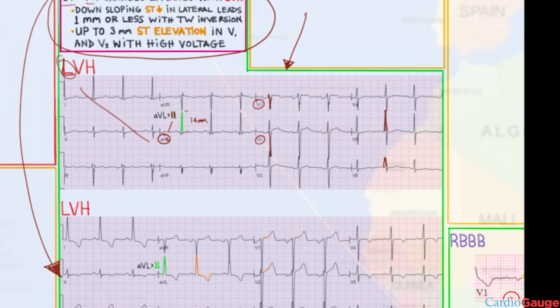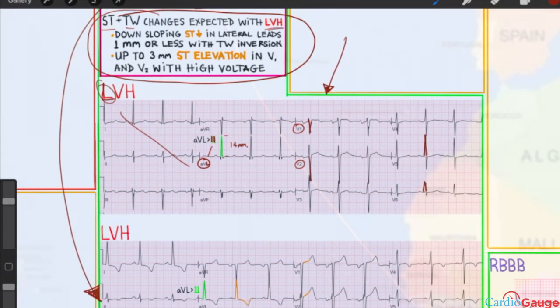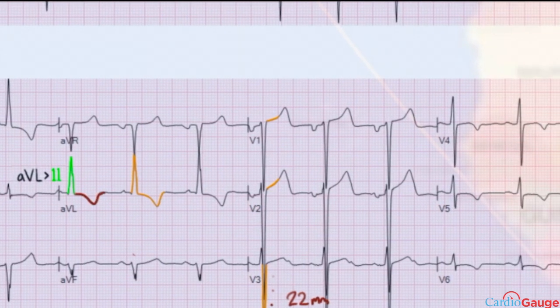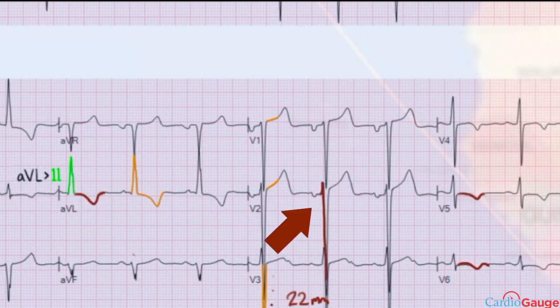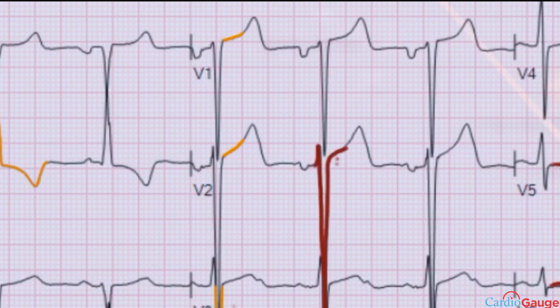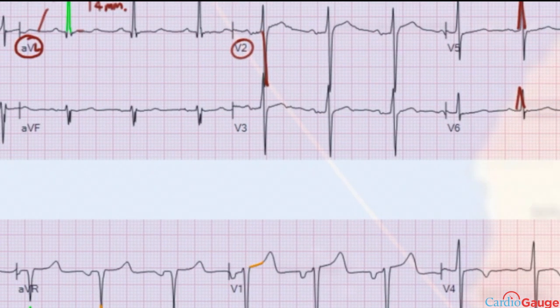There are ST and T wave changes expected with LVH. We expect to see a down-sloping ST depression of 1 millimeter or less in the lateral leads, with associated T wave inversions. Looking at the lateral leads, there's a down-sloping ST segment and then a T wave inversion — visible in all the lateral leads. Additionally, there's up to 3 millimeters of ST elevation in leads V1 and V2, typically with high voltage. For example, in V2 there's a really big S wave and then about 3 millimeters of ST elevation.